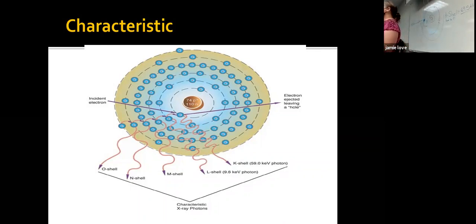That's to make X-ray production. So now we're just talking about, we've already made the electrons jump across. So we're talking about how the photons are made in the tube, and this is on the atomic level.